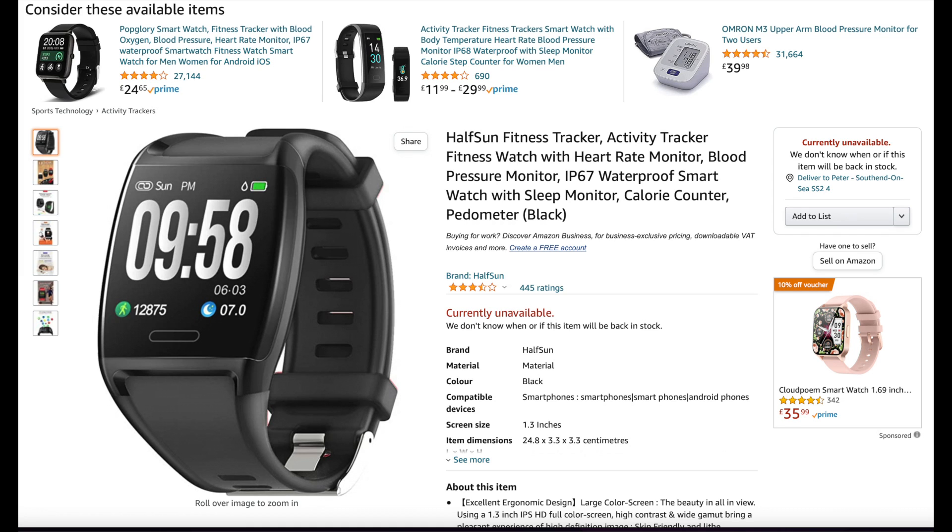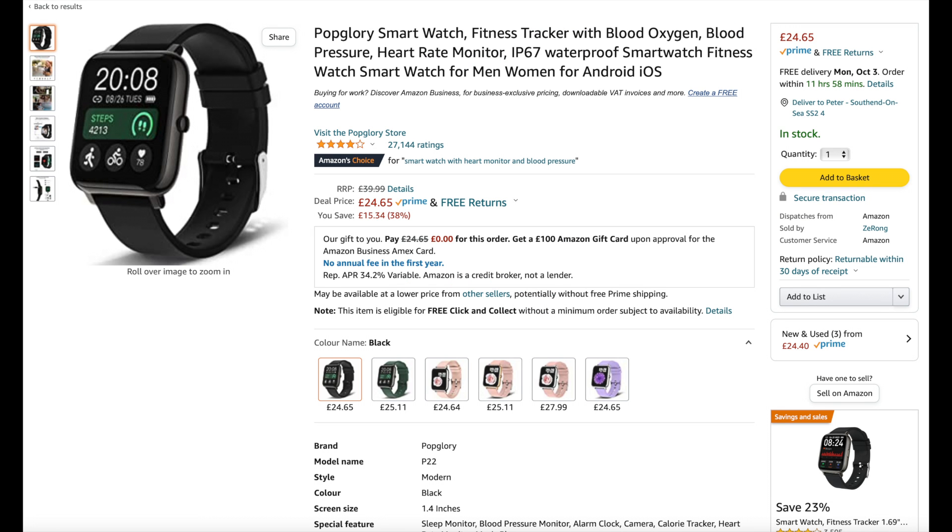There have been many attempts to design a blood pressure monitor that you can wear on the wrist, and if you look on the web you can actually see so many smart watches that claim to monitor blood pressure.